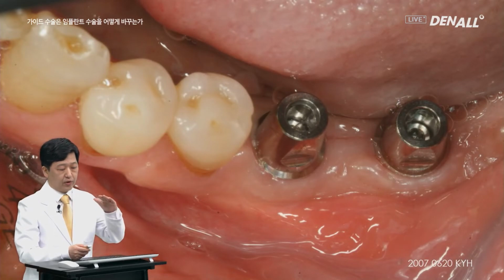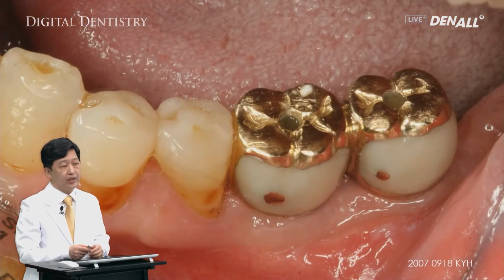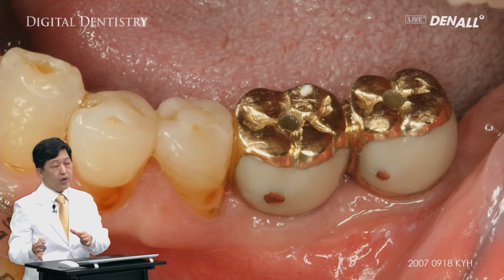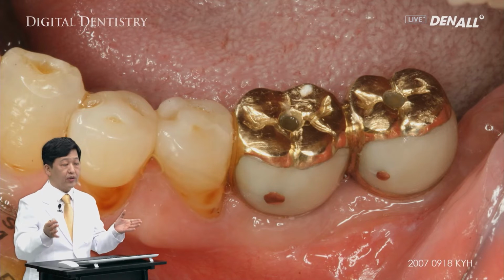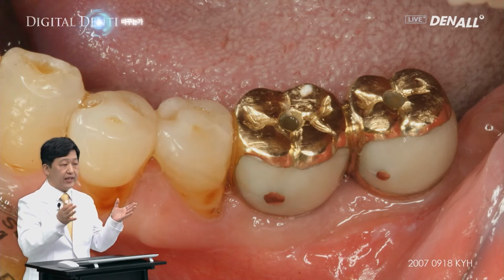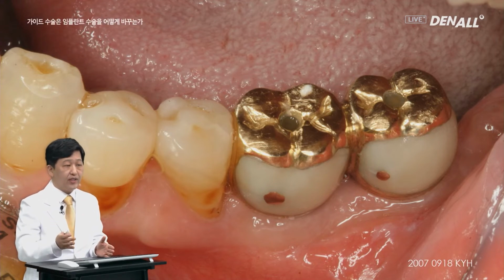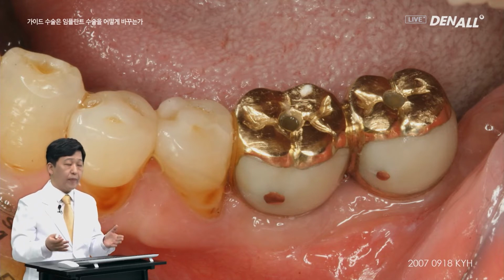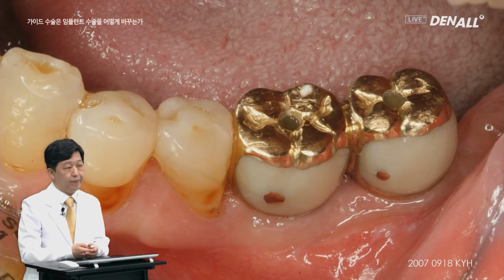After 3 months, stock abutment was used, and as shown, a gold crown was used for prosthesis. This kind of crown is hardly used these days. In the past, a bone graft was done, an implant was placed, a separate soft tissue surgery was done to restore the final prosthesis in this way. Then what changes with guided surgery?